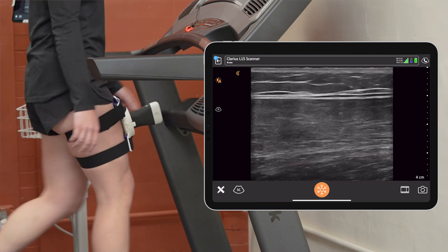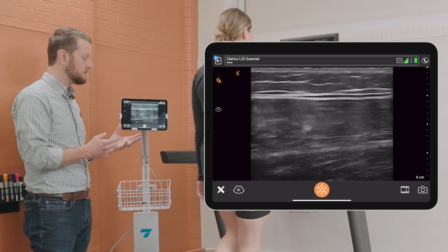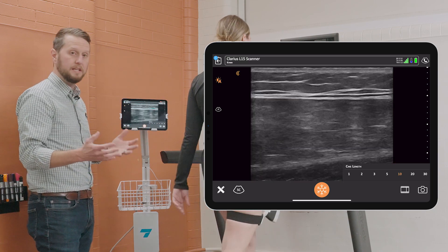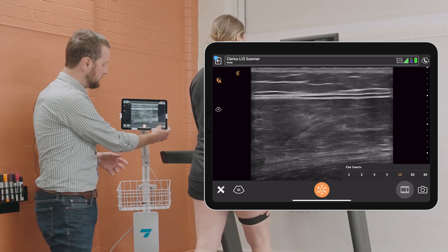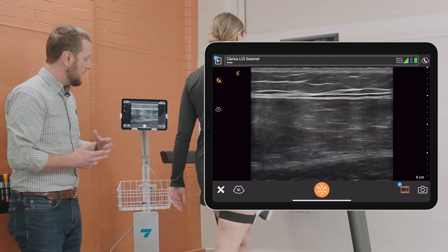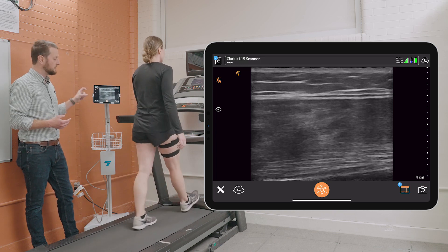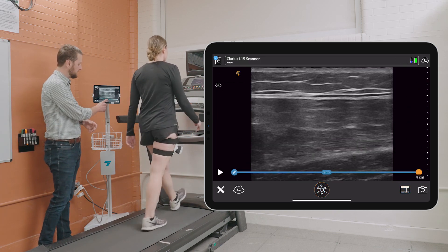So now to monitor and quantify what's happening here, we can take a cine loop video using this icon and select a cine length of either one second up to 30 seconds. I'm going to take a 10 second video here, which is now collecting that video dynamically of her going through this motion and cyclically capturing how that muscle is responding to multiple different steps.